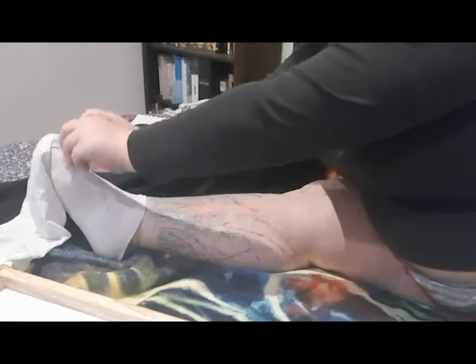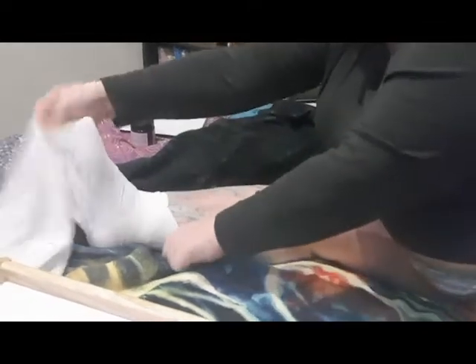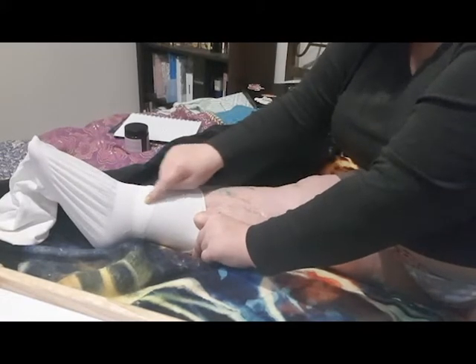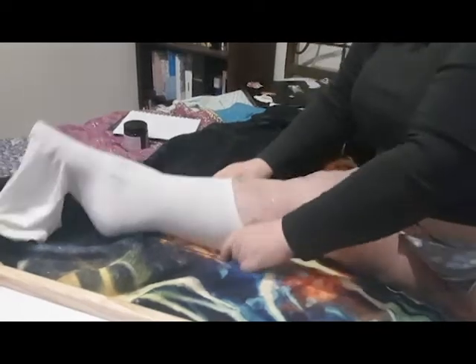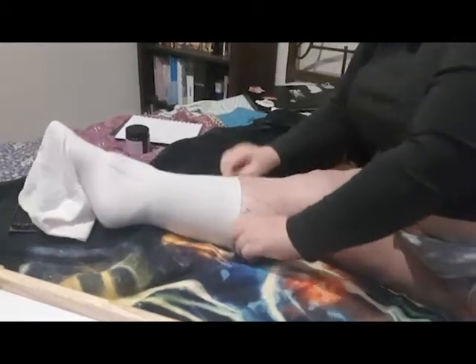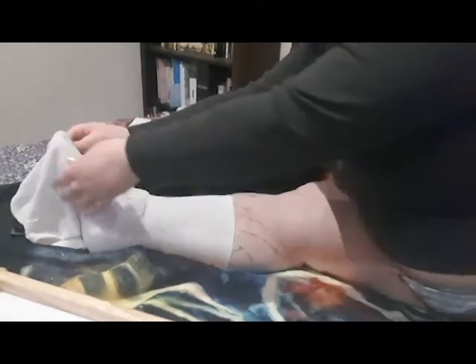This has been the easiest way I've found to pull these on: grab the stocking and pull it back little bit by little bit. You want to make sure that, see how it's doubled up here? That's not allowed to stay. You've got to make sure that it is smooth. You can see here there is no wrinkling, because anytime there's wrinkling, the pressure, the compression will be sticking there. So that means it's going to cause further issues.